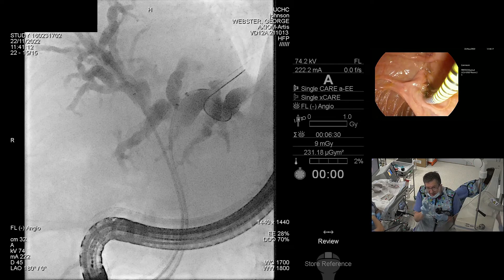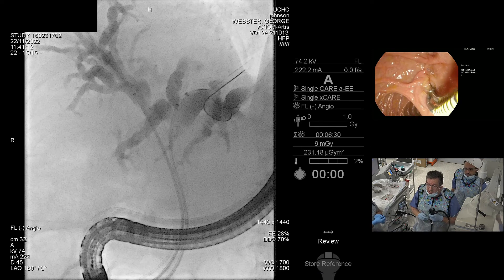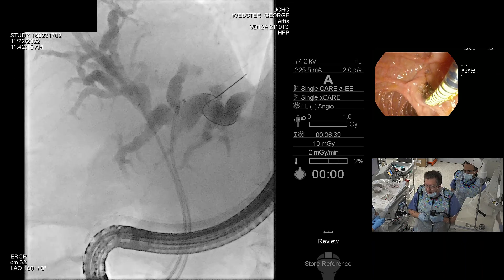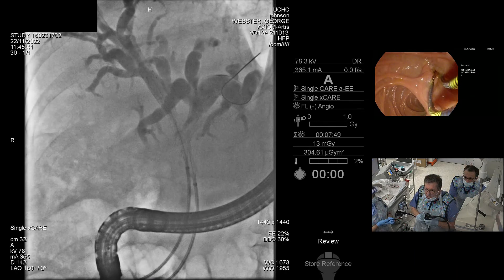We are expecting that where we have those radio-opaque markers, those positions are going to be maintained. I've now got both stents nicely in position in the duodenum. We're going to deploy a centimetre at a time — this is right, this is left. We're putting in bilateral 12 centimetre stents with the delivery system in the right and now going in the left. If you put metal stents in sequentially, you can find that you have a great deal of difficulty getting the second one in. Both deploy together now.